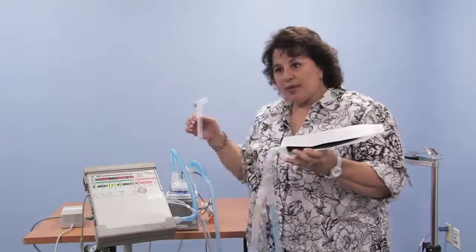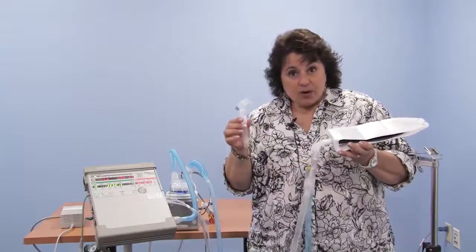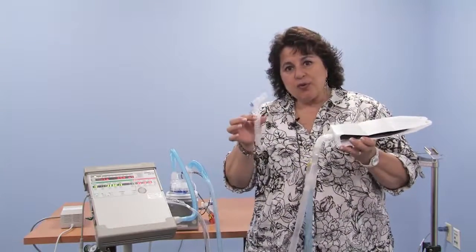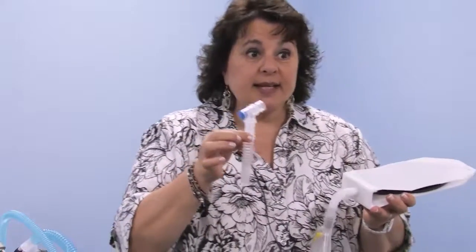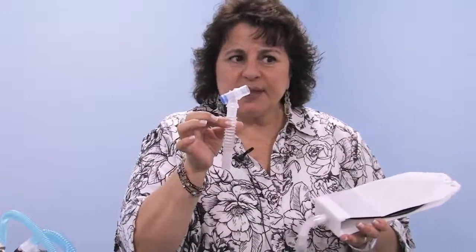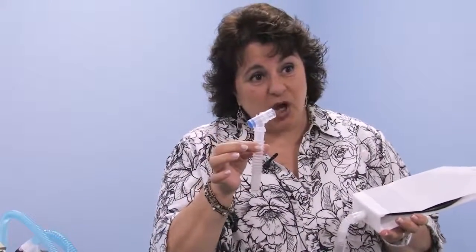So you want to make sure that although you may get things in the mail from your DME company in error, perhaps larger pieces, be sure that you check with your respiratory therapist about what piece is appropriate for your child. We cannot lengthen this very long without challenging the child to breathe more dead space air. If you have a large breath like an adult would, then this amount of air in here, maybe 35 cc's of air, isn't going to make a big difference to your size of breath. But if you're 6 months old and your size of breath is 50 cc's, this would be almost half of it, and that would be a lot.